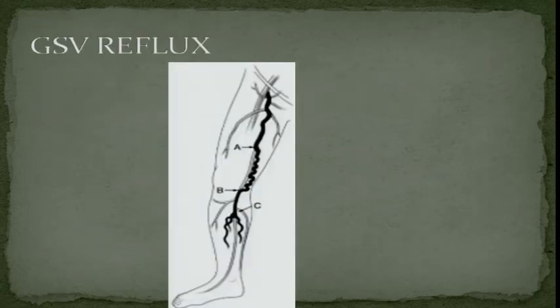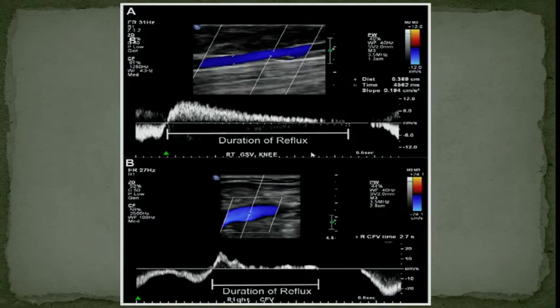Yeah, great. So what is the grade of reflux here? Severe. Very good. Now Louise is wide awake. This is 1, 2, 3. So you just measure the seconds and you can grade the reflux.